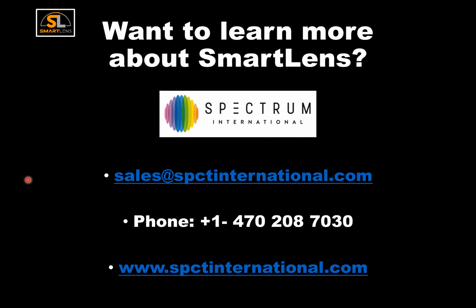So we've been really happy with systems like ClearCare that are leaving the lens in that neutralized fluid. Of course, rigid lens fluid is always good.